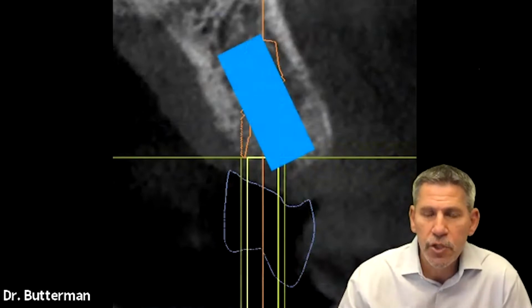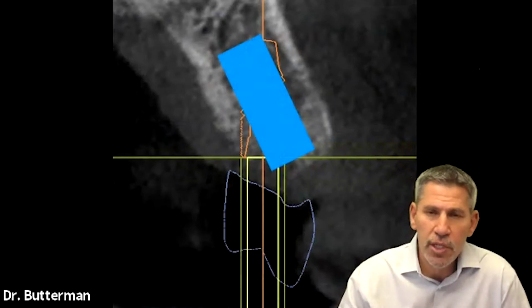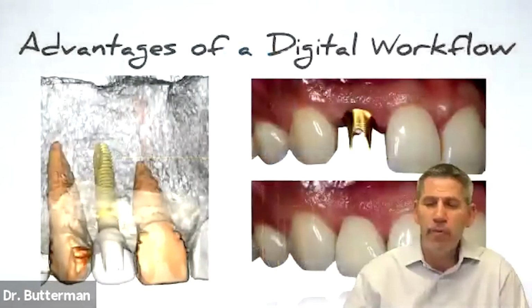So we do want to make sure that we're really evaluating all of these things. I do this in front of my patient, and you'll see in a minute how I plan. I do this in front of my patient before surgery.